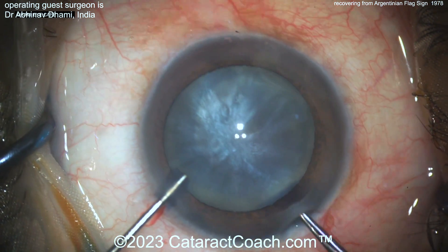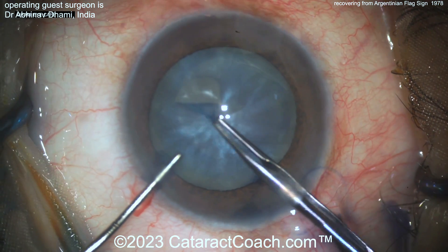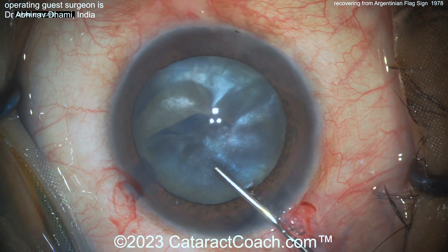Here's some TriPan blue dye to stain the lens capsule. And now — it's pressurized. This is where I'd like a needle decompression or double-rhexis technique. Watch carefully — there it goes. It's gone, all the way out to the zonules.